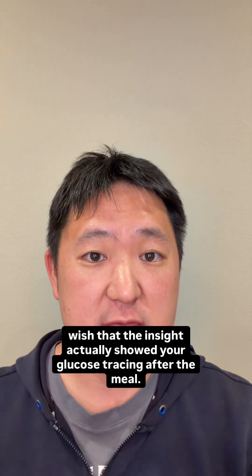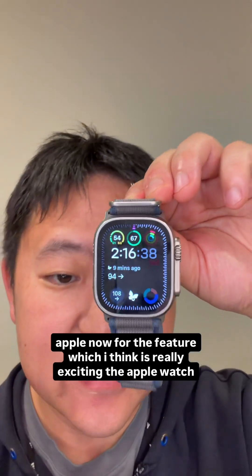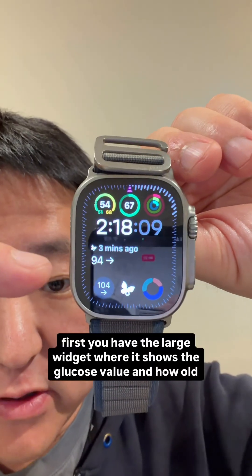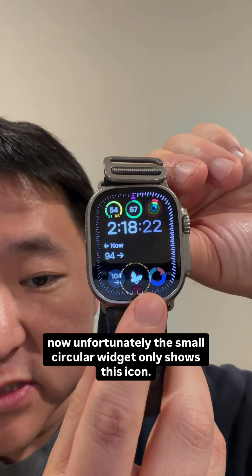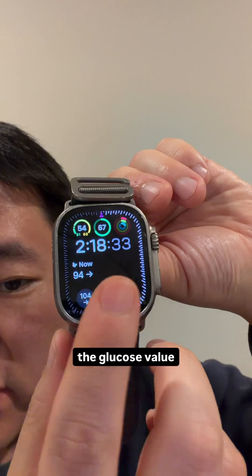I really wish the insight actually showed your glucose tracing after the meal. Now for the feature I think is really exciting: the Apple Watch app and widget. There are actually three ways you can look at the widget. First, you have the large widget which shows the glucose value and how old it is. Unfortunately, the small circular widget only shows an icon — it's a shortcut to pull up the Libre app, but it doesn't actually show the glucose value.